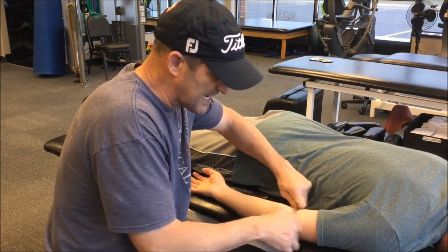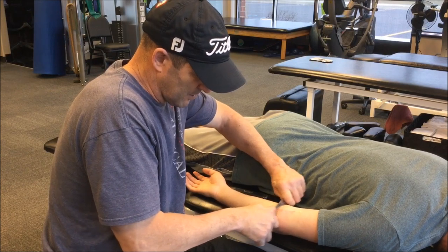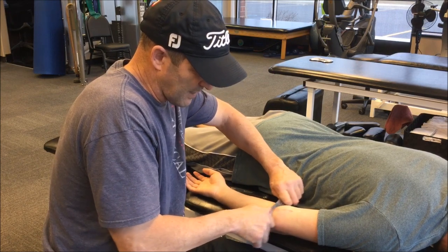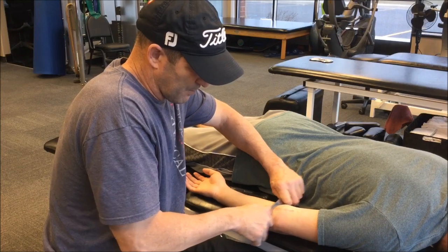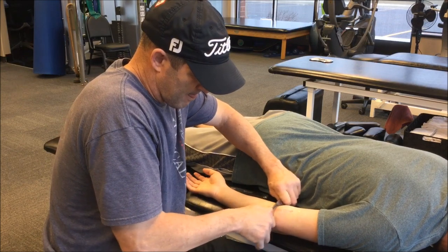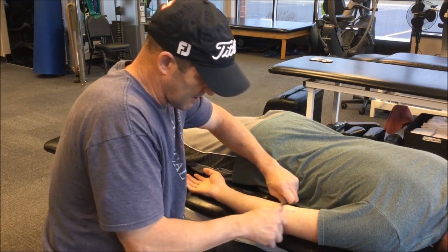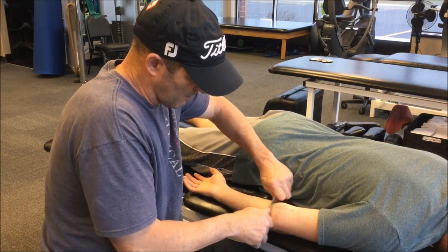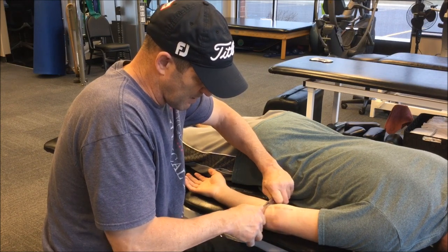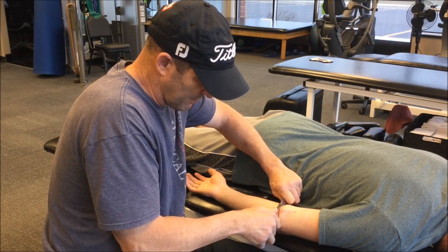You're going to see some redness and a little petechiae. He's mobile above the epicondyle but hypomobile below. So I'll get a little more pressure and go over and over. I'll spend about one to two minutes on it. Sometimes I'll just change the angle a little bit — working more the medial part of the scar, then more towards the lateral part. You can see it get tethered up right there. That's why the Graston tools are so nice — you can push up and see where it blanches, then feel where it's tethered.